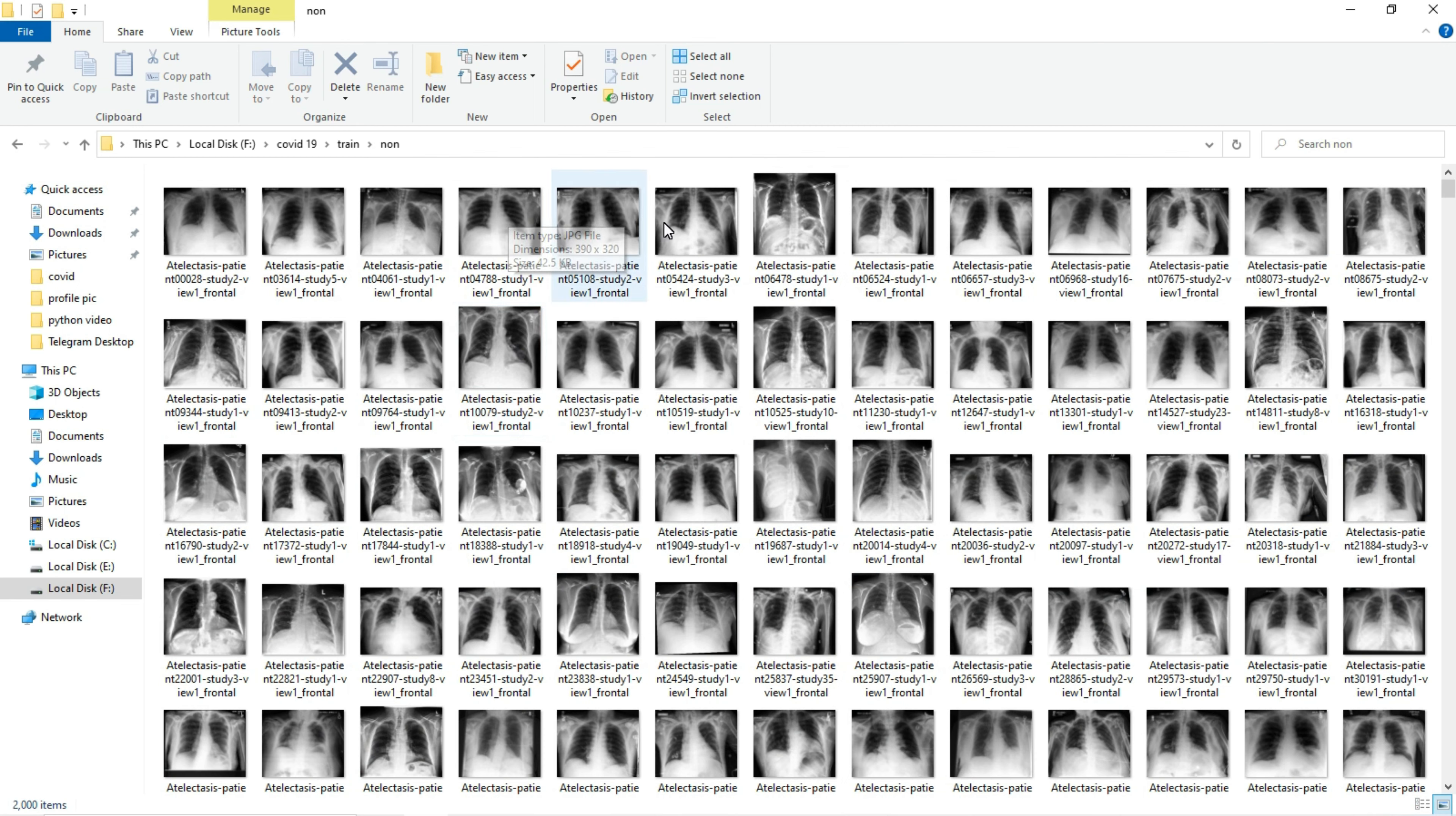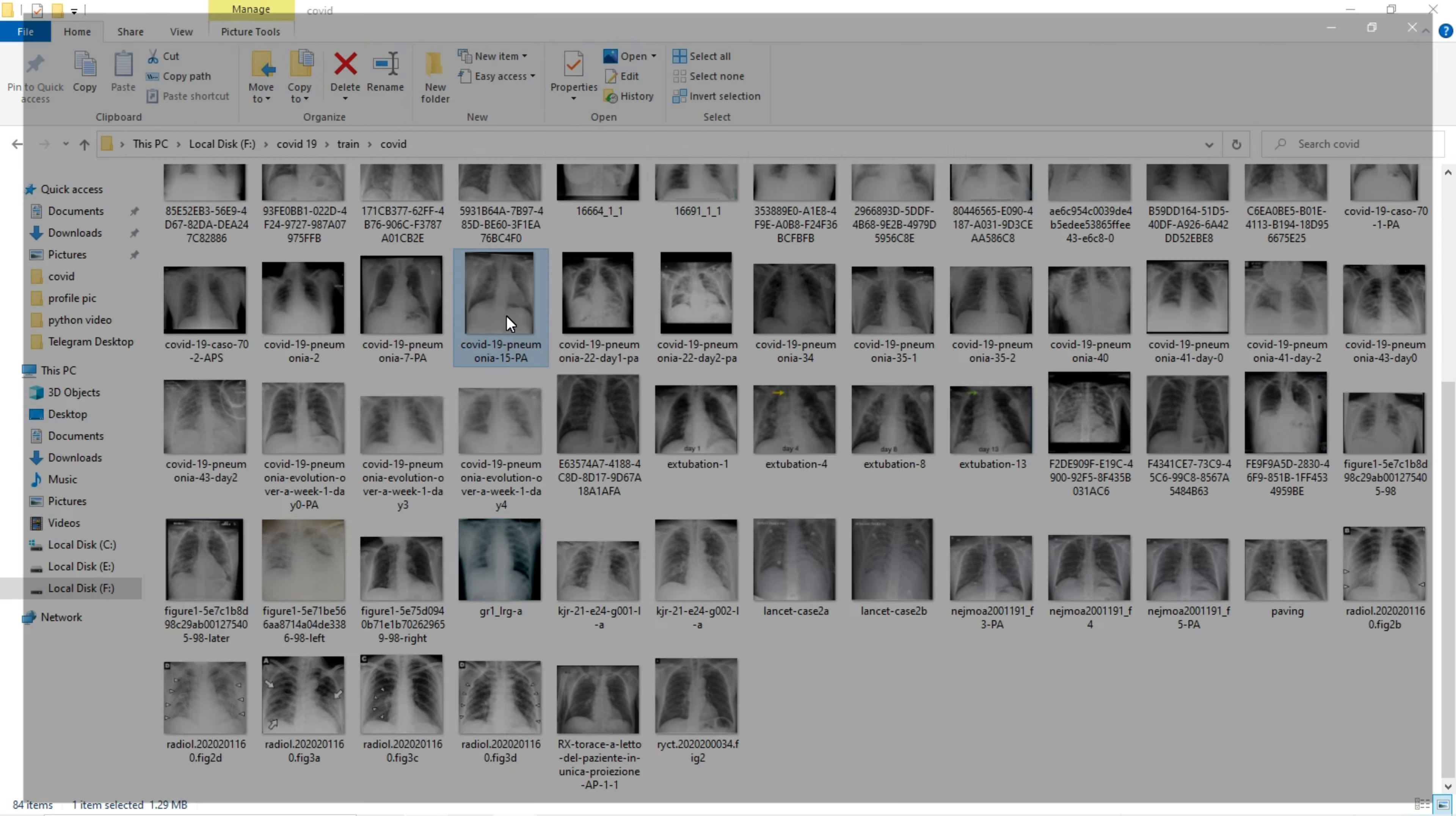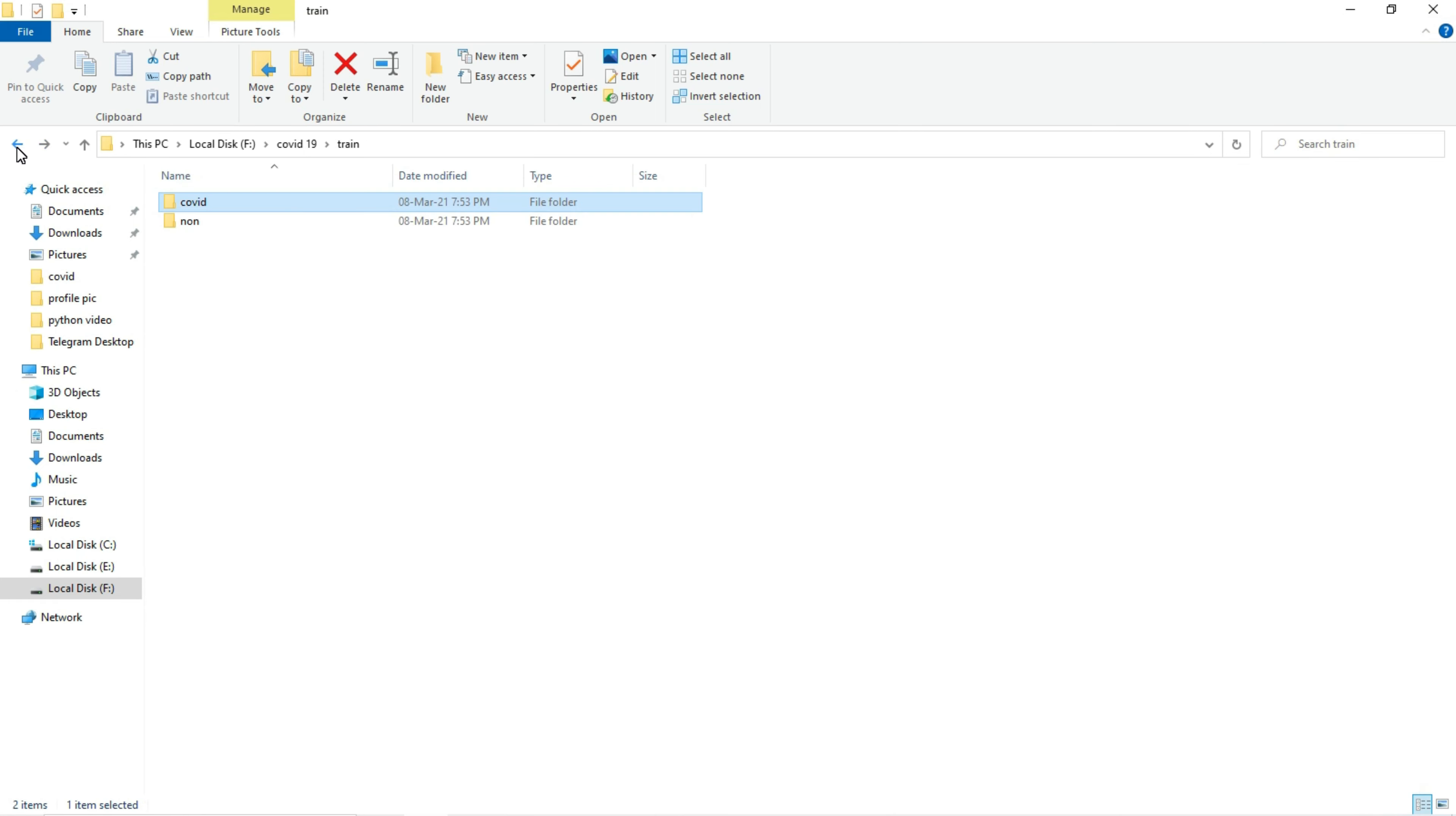Here the lungs are normal, but in COVID images you can see the lungs are affected by the COVID virus. I have a few samples to train my machine learning model.